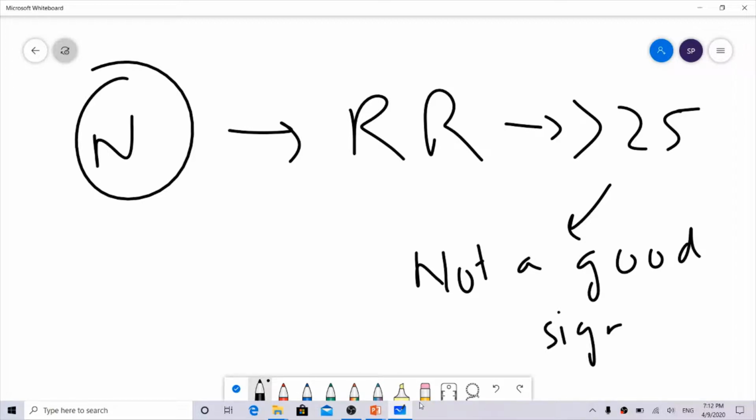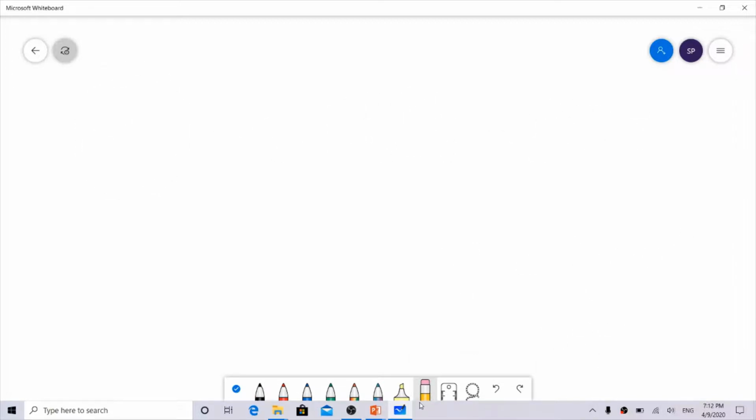And then there are other parameters. One last parameter which we always try to see is the NIF, the negative inspiratory force. Just like whenever we try to take in a breath, it's negative pressure ventilation. At a physiological level, you need it to come to somewhere into the negative.